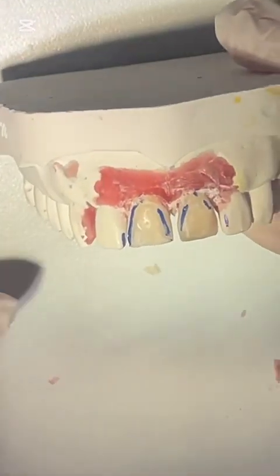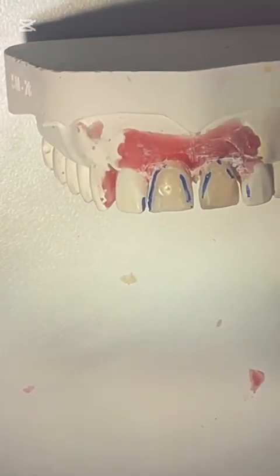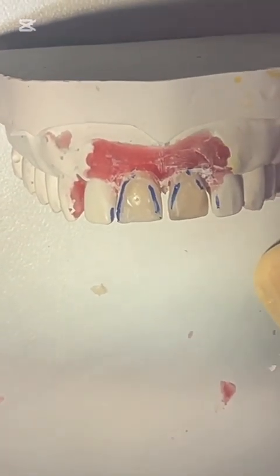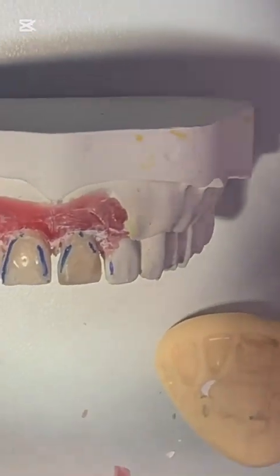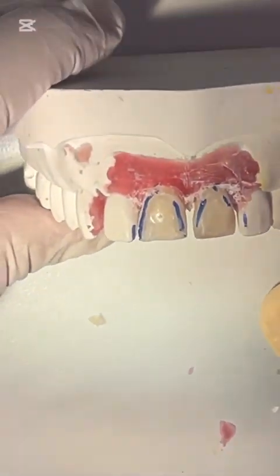Okay, so now I removed all the mock-up composite. How can I prepare the enamel surface for composite restoration? I should do beveling. What do we mean by beveling? Removing the superficial hypermineralized area, because this area, as it is strong, as it is rich with the strong fluoroapatites, it will resist the acid etching. So I need to decrease this area, and I will do beveling.